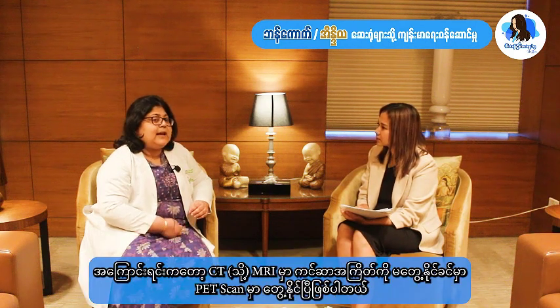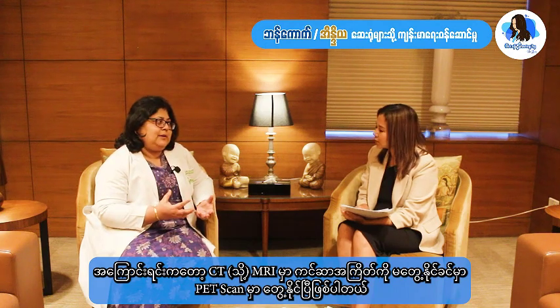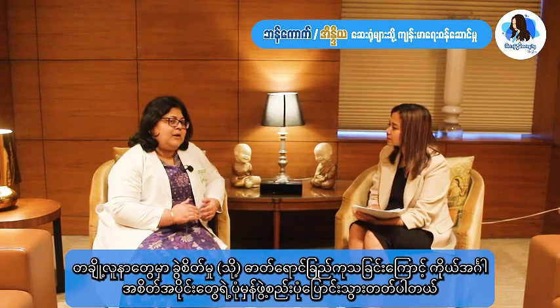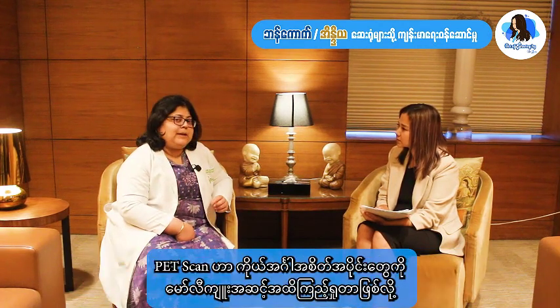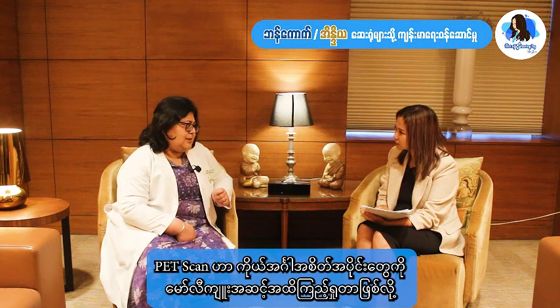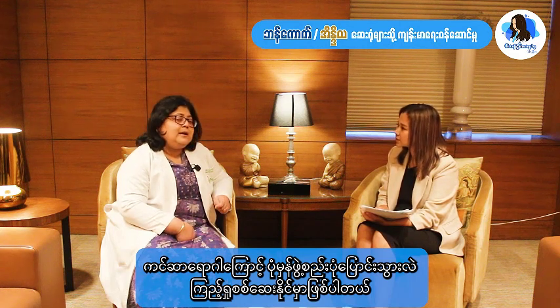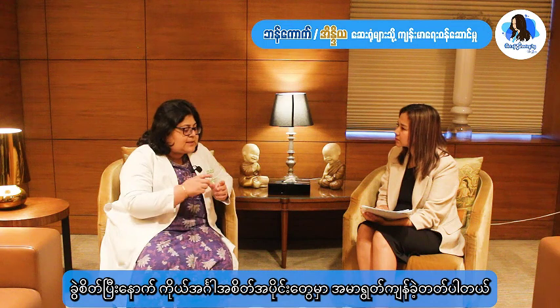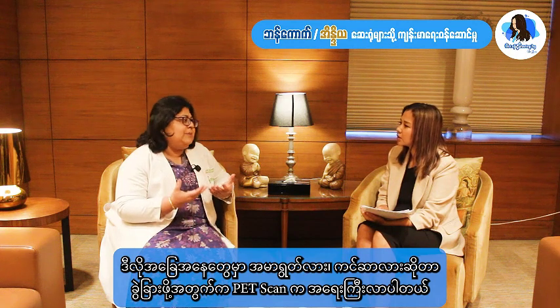The reason is the PET scan detects the disease way before you actually develop a tumor on a CT or an MRI. And sometimes when the patient has surgery or radiation and there is some distortion of the normal structure, the PET scan, because it looks at the molecular level of the disease, is able to detect the cancer despite the structural changes a disease can create. Post-surgery there may be some scarring, so how to differentiate between active cancer and scarring, that is where the PET scan comes in.